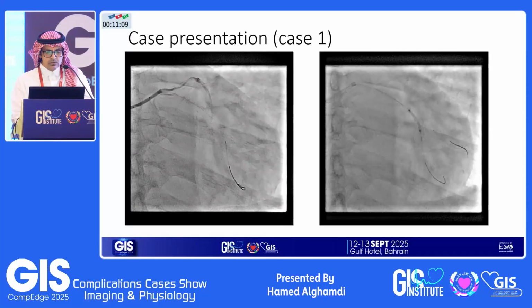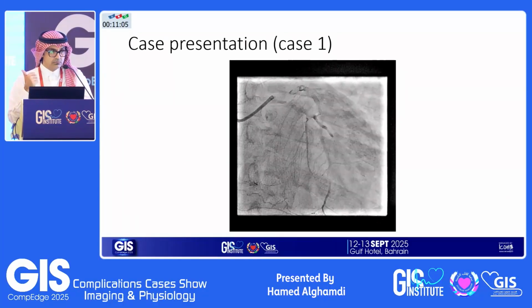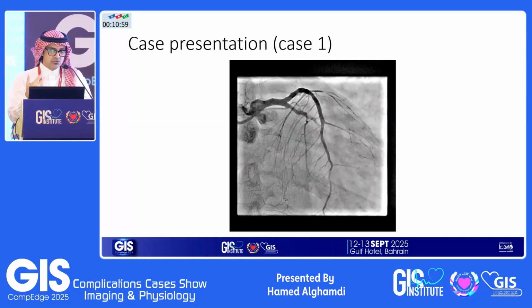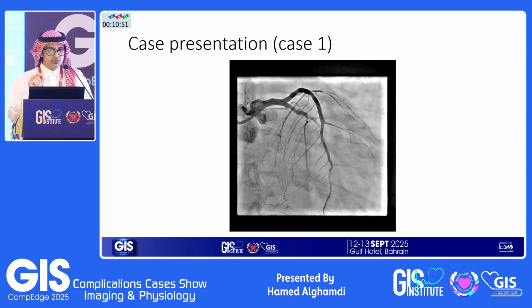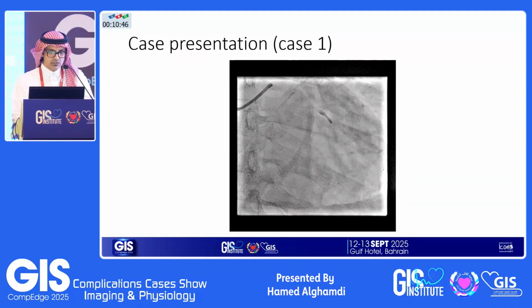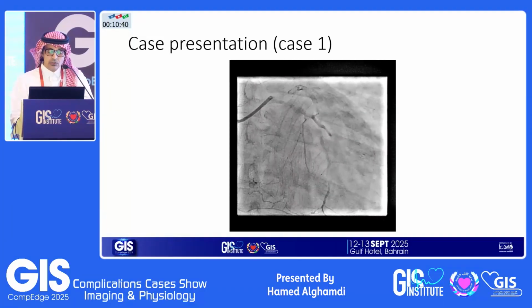Some ballooning the usual way, and this is after thrombus aspiration, which yielded minimal clot. We pushed the catheter distally, injected some vasodilator, glycoproteins, but nothing would give us decent flow. Luckily, the patient was asymptomatic. His chest pain settled, and his ST segment improved significantly. So I decided throwing a stent there might not do this patient good in the acute setting.